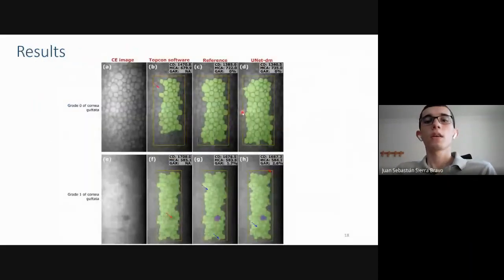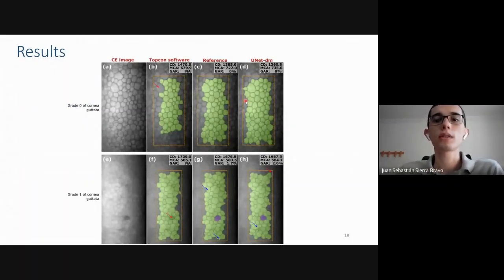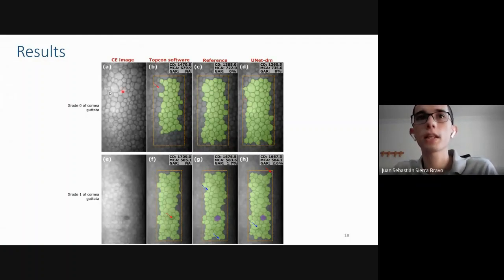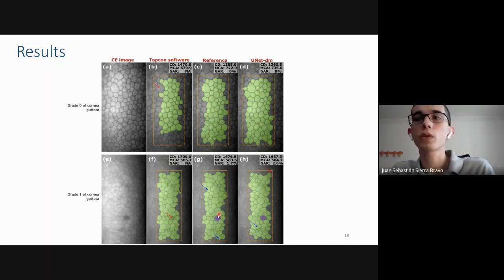Now I will show you our results. Here there are two examples of different health conditions. In the first column we have the cornea endothelium image, then in the second column we have the Topcon software segmentation, then we have our reference, which were the manually annotated segmentations, and finally we have the U-Net DM, which is our proposed method. Overall, all three segmentations in the two examples are very similar. One of the most important details is that the Topcon software misclassified this small gutta as a cell, and this was corrected and well classified in the reference and by our model.